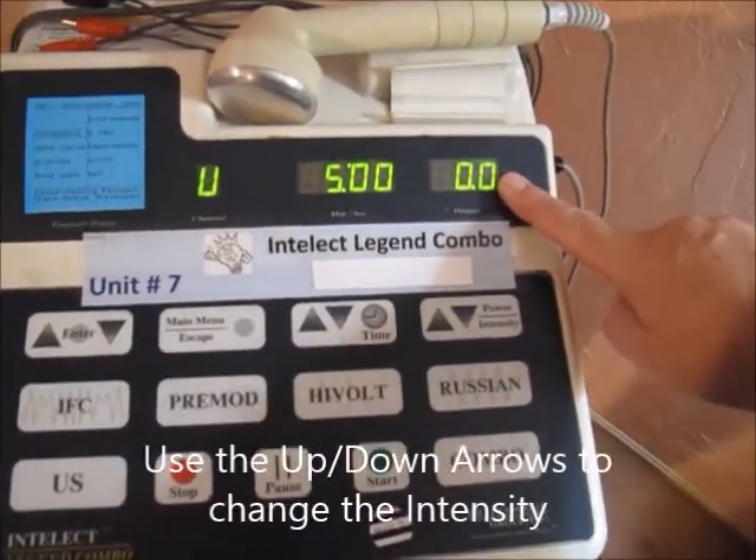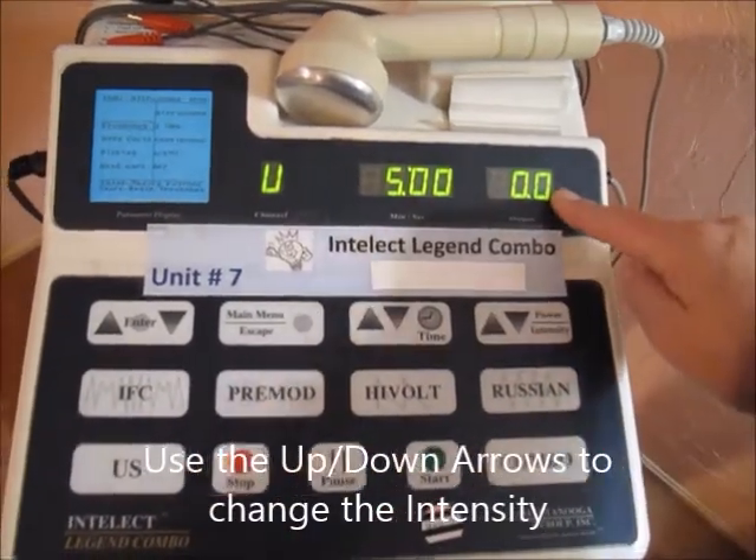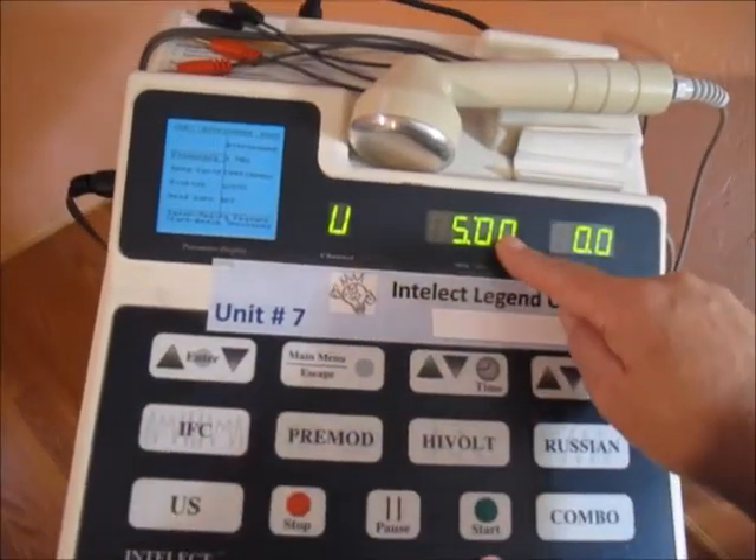This is the output screen right here. This up-down arrow power intensity will allow us to change that. This is how we change time.